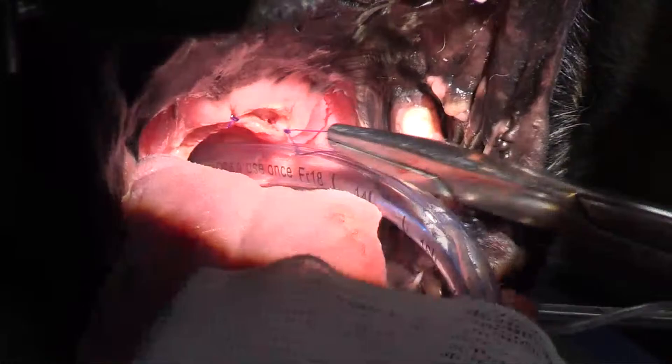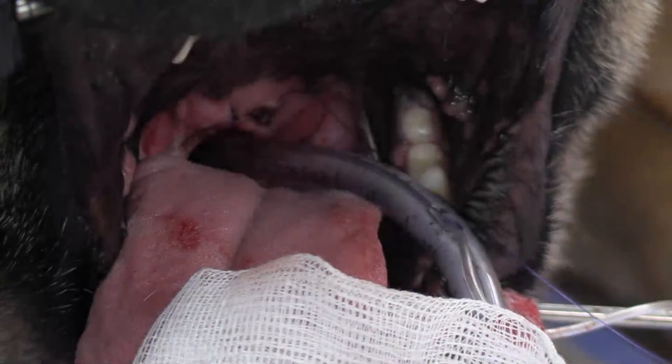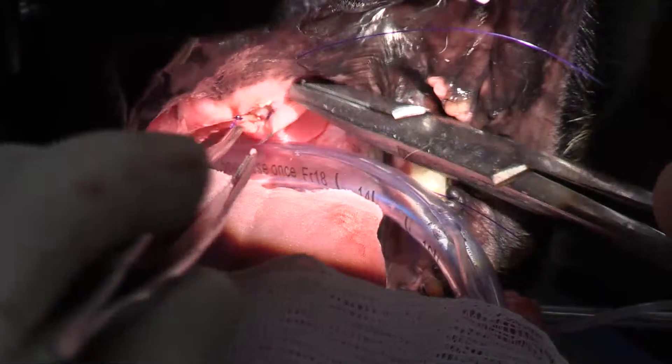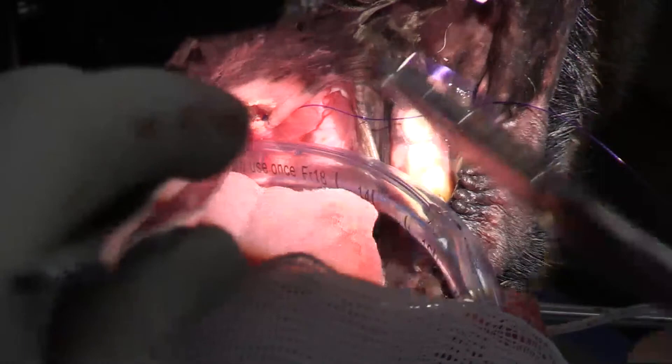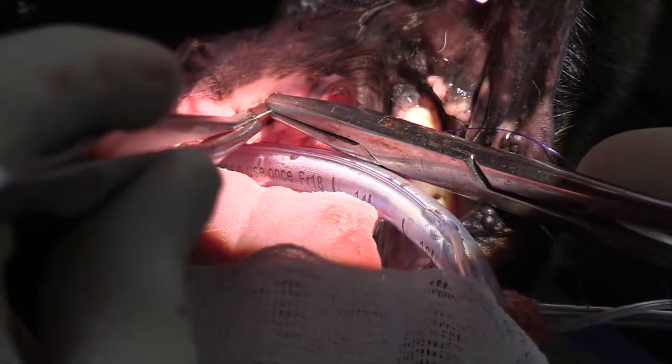If you only have a regular electrocautery, what you would do is dissect the thickness of the soft palate using Metzenbaum scissors, and then do pinpoint electrocautery for the individual bleeders. Some people do simple interrupted sutures — I'm lazy so I always do simple continuous whenever I can.